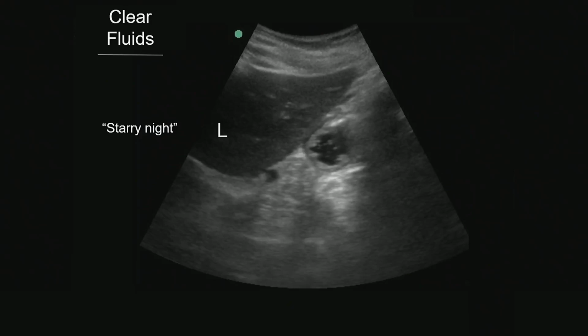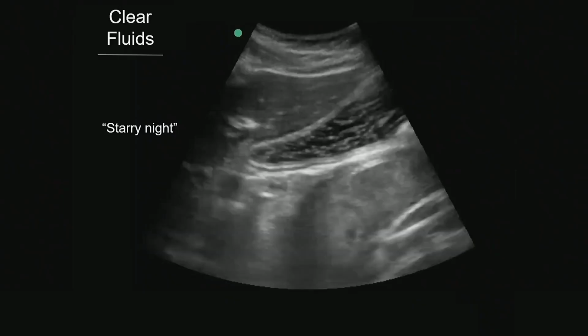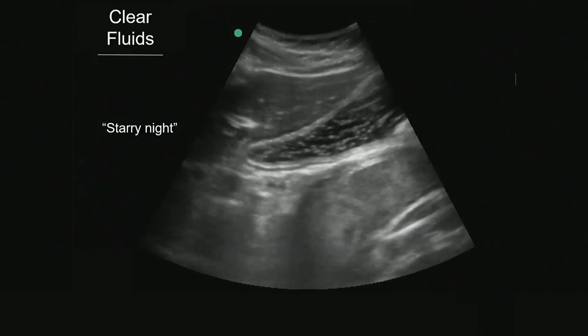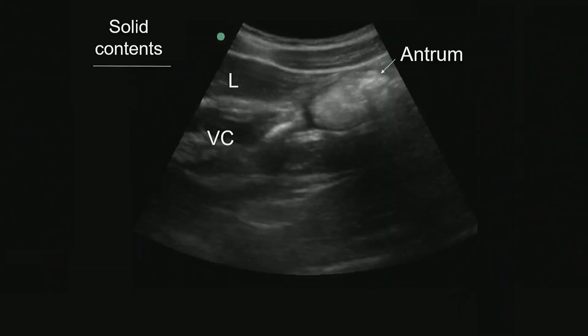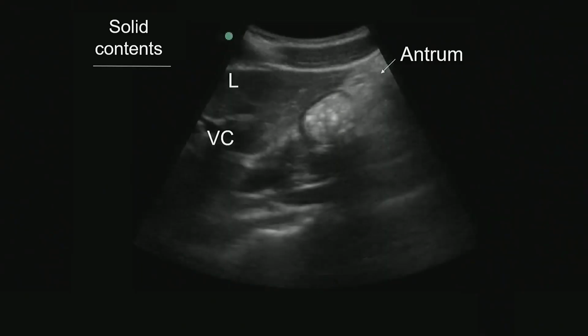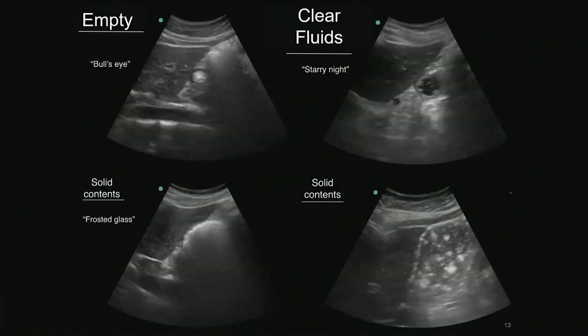When you have more fluid, you are able to see these invaginations of mucosa. You have these white dots. Those are air bubbles. You always have them. This is probably the body. You have a lot, but if you wait some time, these are going to dissipate. When you have solid, you're going to have a lot of air, and over time, the air will dissipate, and definitely you don't want to have this situation during your GA.